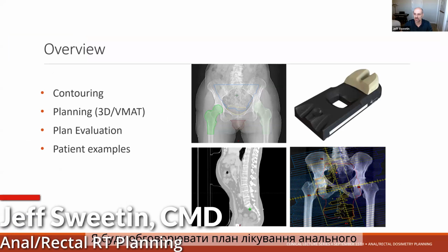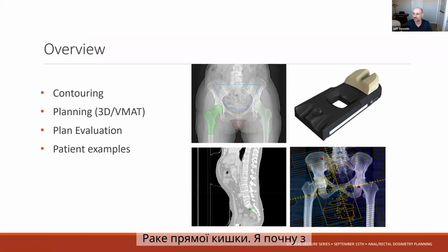I'll be discussing the treatment planning for anal and rectal cancers. I'll start by sharing my screen here.